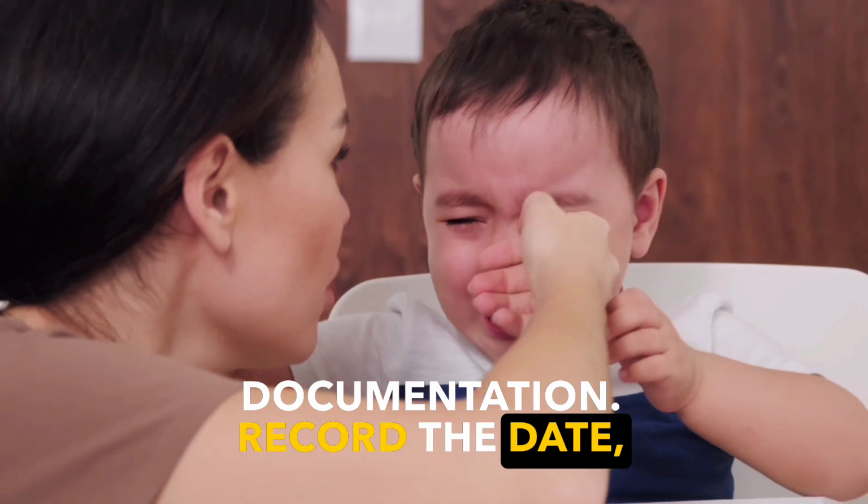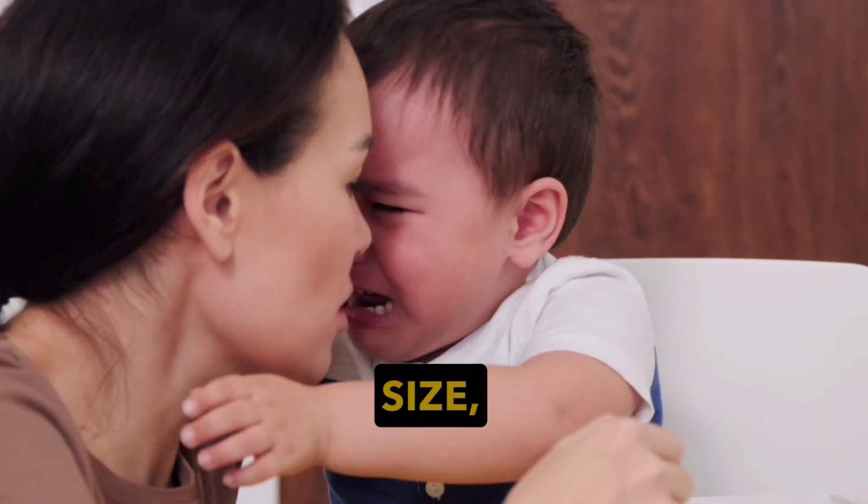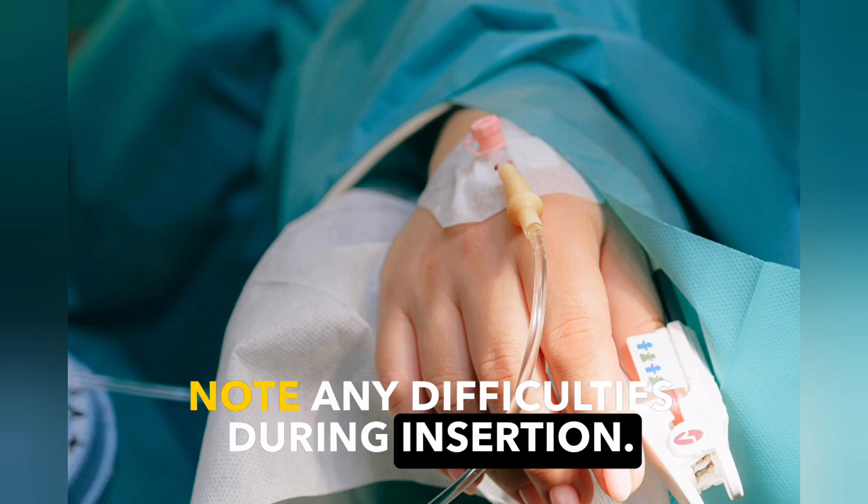Documentation. Record the date, time, site, cannula size, and the child's response. Note any difficulties during insertion.